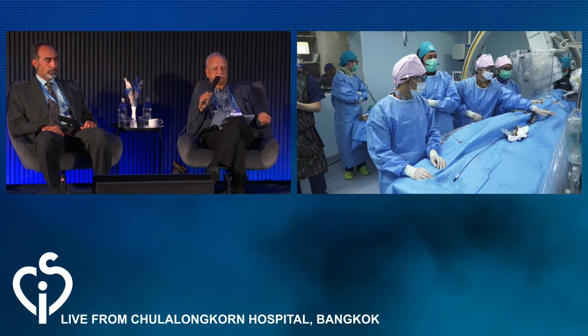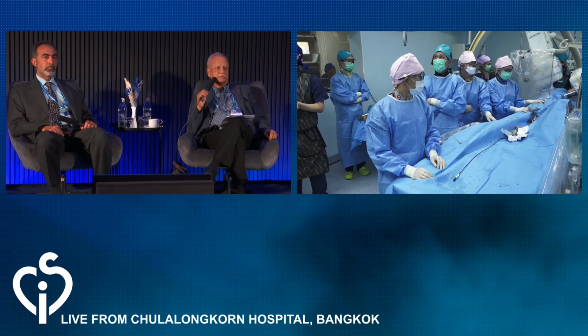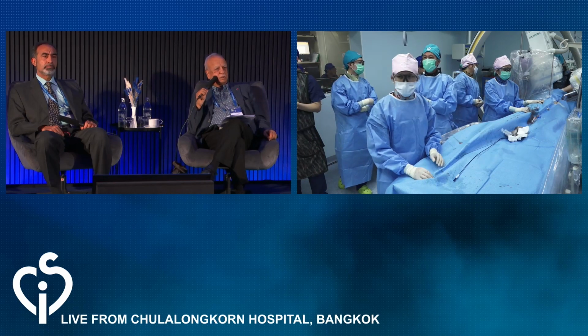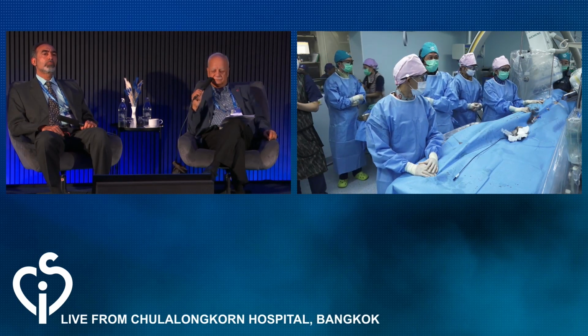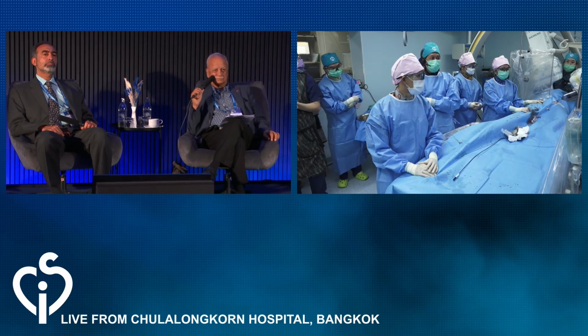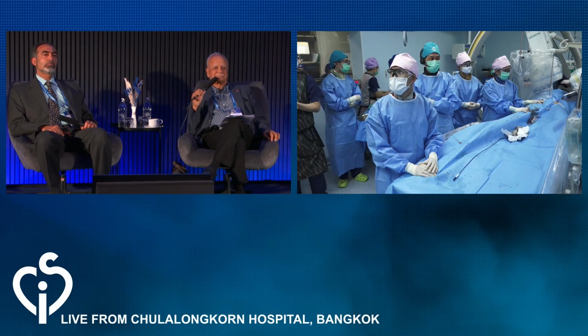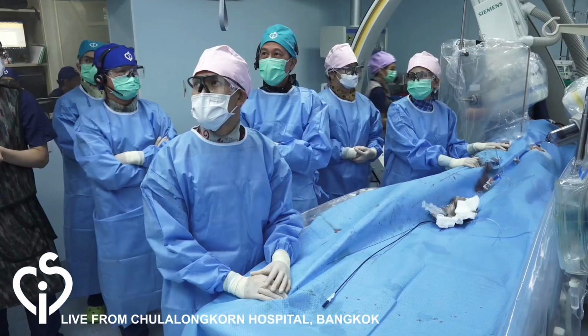Yeah, Bharat? The question I wanted to ask was, we have made these measurements at the point of exit, and as you know, this is a windsock kind of deformity. The question I want to ask the operators as well as the panelists is, which is the right place to close this defect? At the mouth of the fistula or at the exit level?